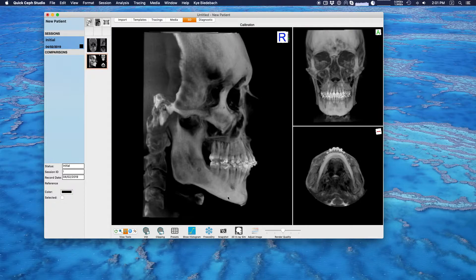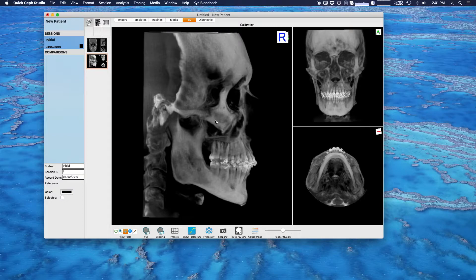Now if I wanted to trace this I would just click freeze dry. Clicking freeze dry will create a lateral, frontal, and submental vertex x-ray, place them in your import section, and calibrate them so they're ready to trace. If you use freeze dry you do not need to manually calibrate these.